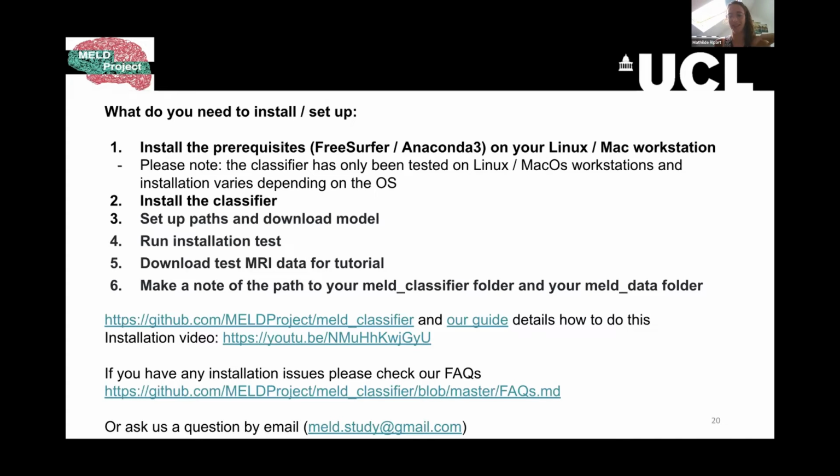Just to clarify, there are two things. One, the current pipeline will break because some of the FreeSurfer functions we're calling have changed in 7.3. And the second thing is we could try and point you in the direction of where those things have changed. But even if you solve them, we can't take any responsibility for how the software will work. We never tried it on 7.3, so we can't vouch for it. So I cannot blame my installation not working on that? It's a problem with the processing.